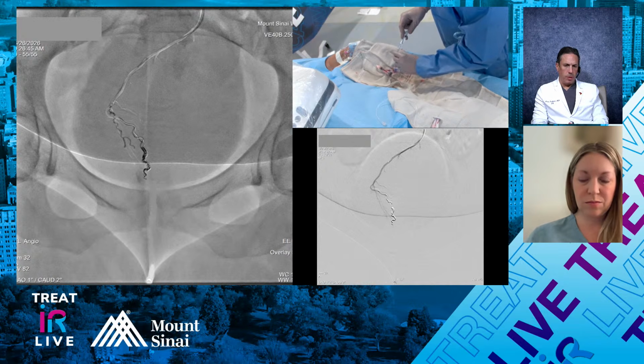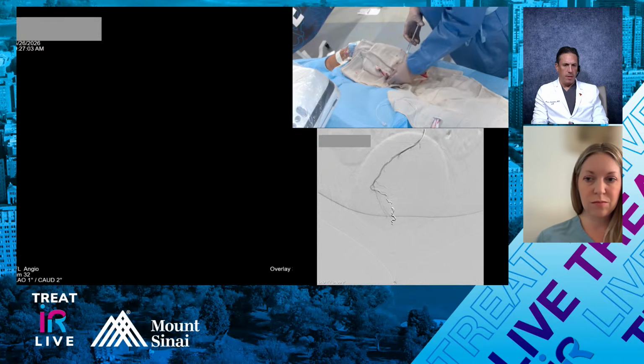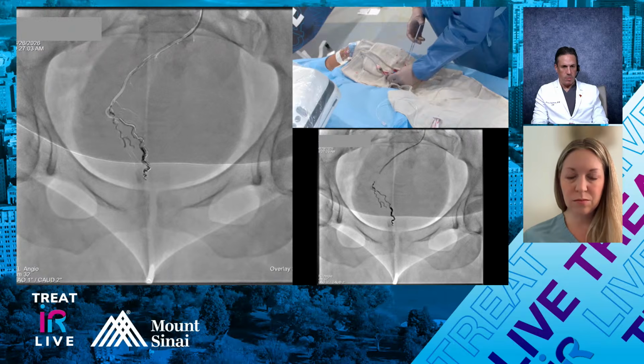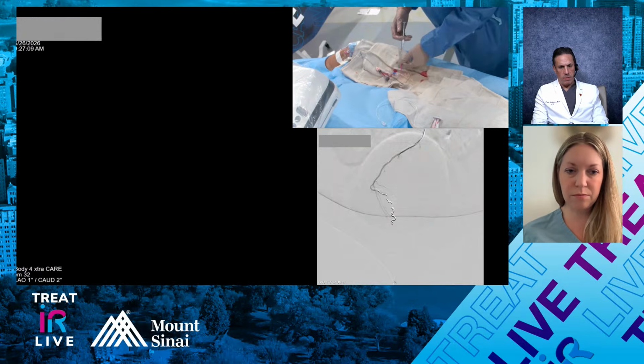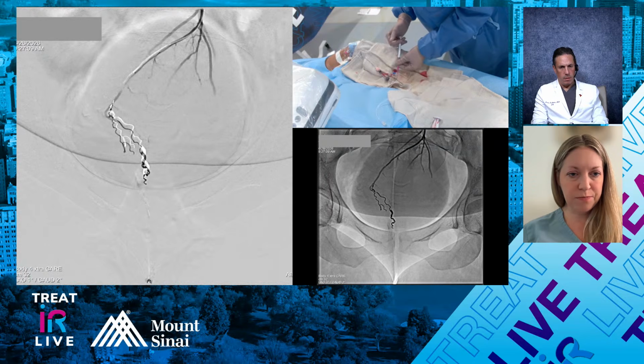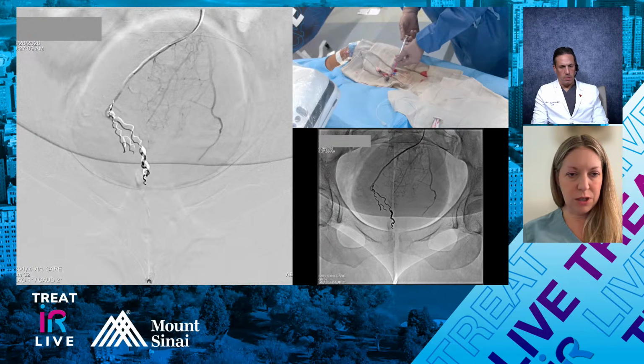Well, yeah, and that was a 2.8 coil, by the way. Just a 2.8, not a 3. That vessel is not going to accept any coil perfectly. I mean, it's so small. Tiny. So actually we're just trying to get a good result for that size coil, I think. Laying them out in this location, I think, is a totally fine way to go. Yeah, all that looks great.